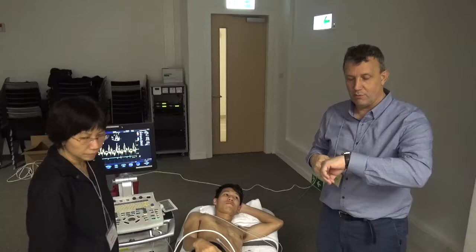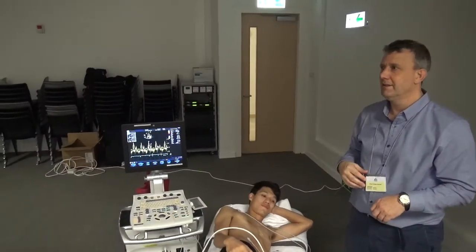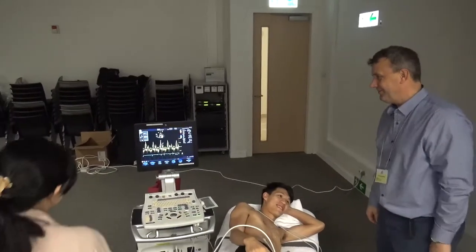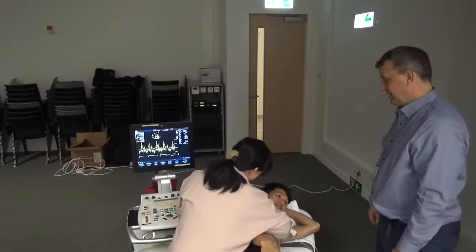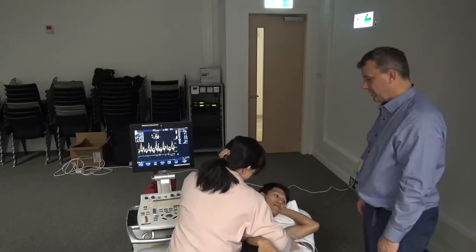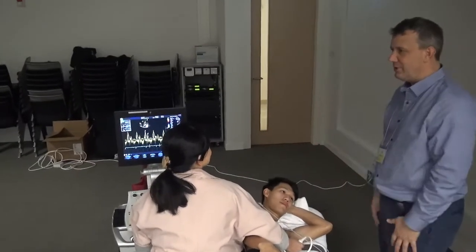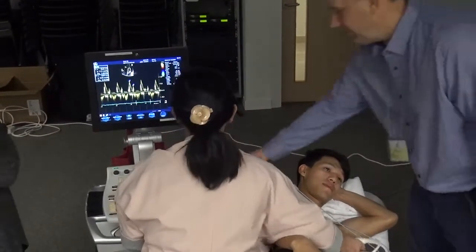Okay, time for one more person to have a go. Just take the strain off everything, okay? Come on, come and have a go. Okay, so whichever one you want to do, short axis or long axis or apical view, which one do you want to do? Apical, okay.